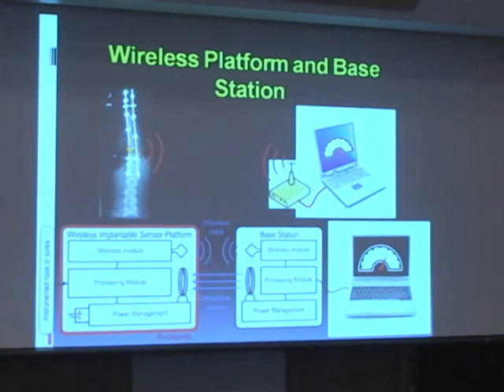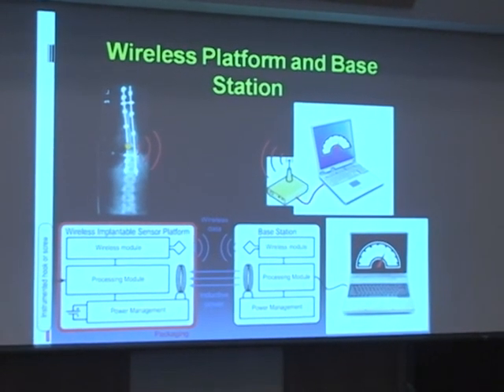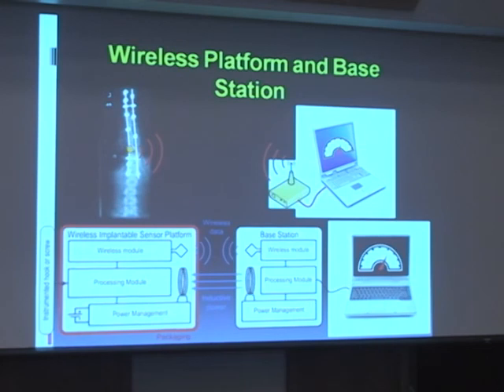Right now, in one of the designs, we are still using inductive power for the device. But we also have a PhD student working on kinetic energy, generating energy based on body movement. That's not a new idea either, because a lot of companies are working on the same idea, using kinetic energy or the heartbeat to generate energy. The market is huge, with people talking about $1 billion going into that market, so we are also working on that. And on the sensor side, there are a lot of different devices that can attach to this wireless platform as well.